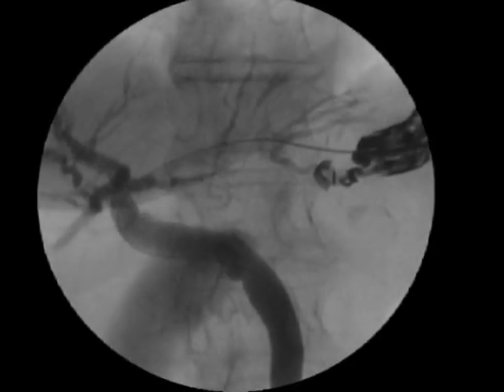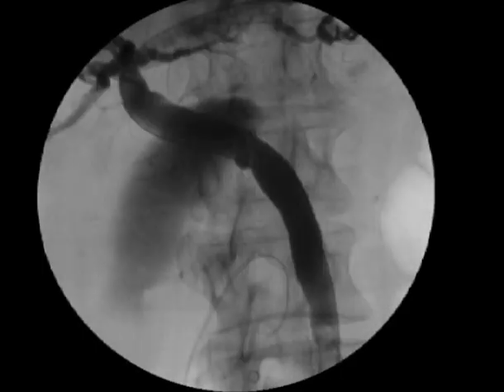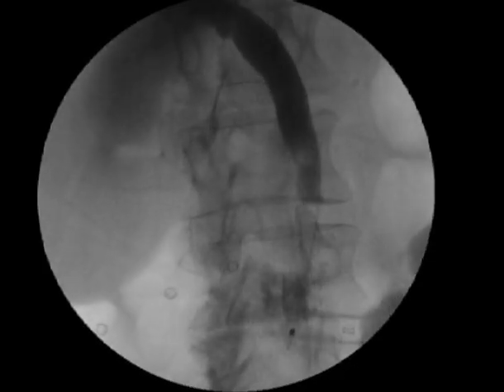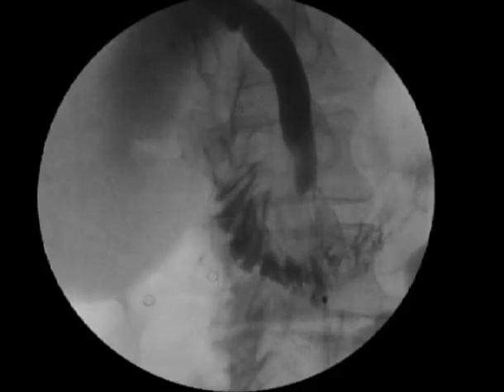A guide wire is then inserted and advanced through the CBD across the ampulla into the duodenum. A catheter is inserted over the wire for tract dilation and is advanced to the duodenum. Contrast is injected to confirm correct positioning.